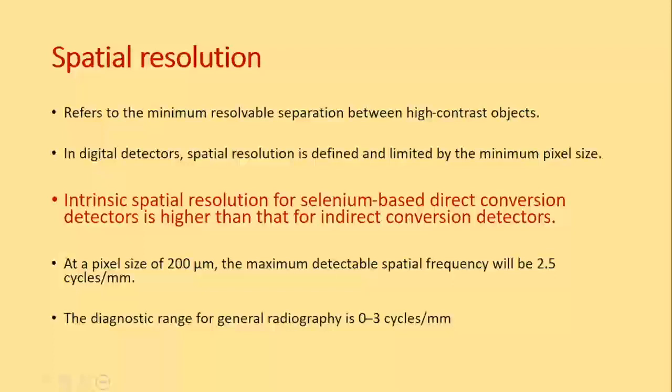And how about our beloved panoramic radiograph? The pan can see roughly 8 to 10 line pairs per mm. That was 18 to 20; the pan is 8 to 10. It means the pan is pretty blind. It can't see much. Hence, we say, not good. The pan is not too clear. So then we go back to the IOPA, the intraoral periapical, because it gives you more finer details.